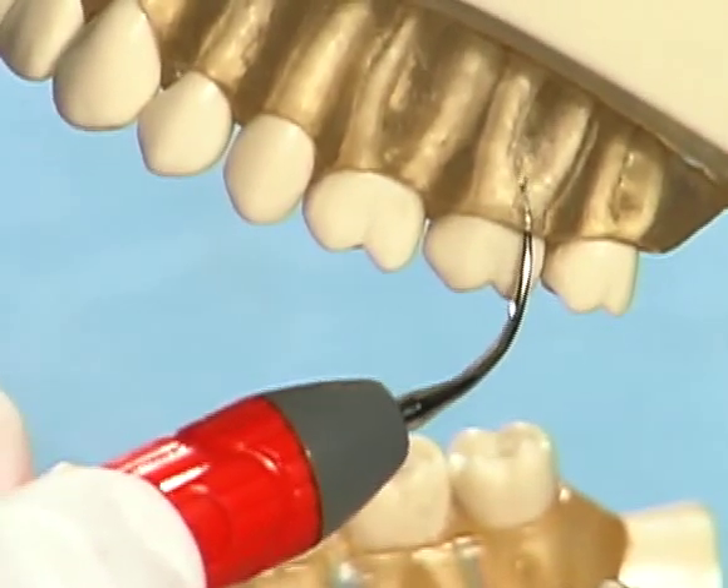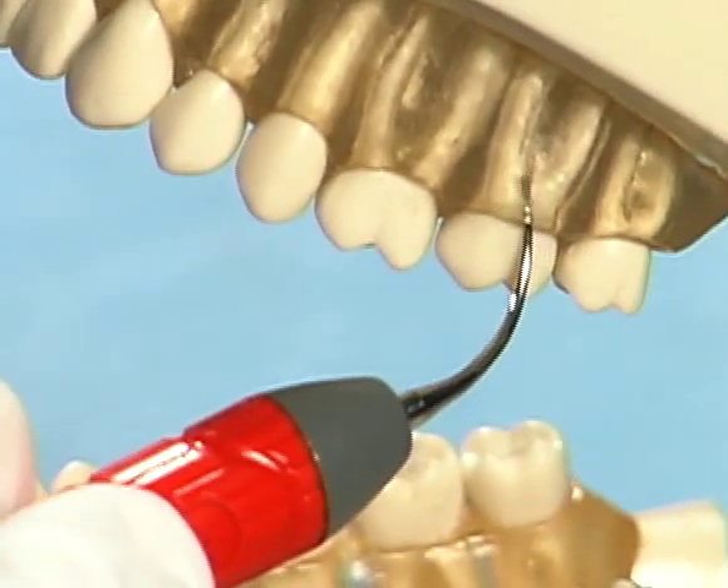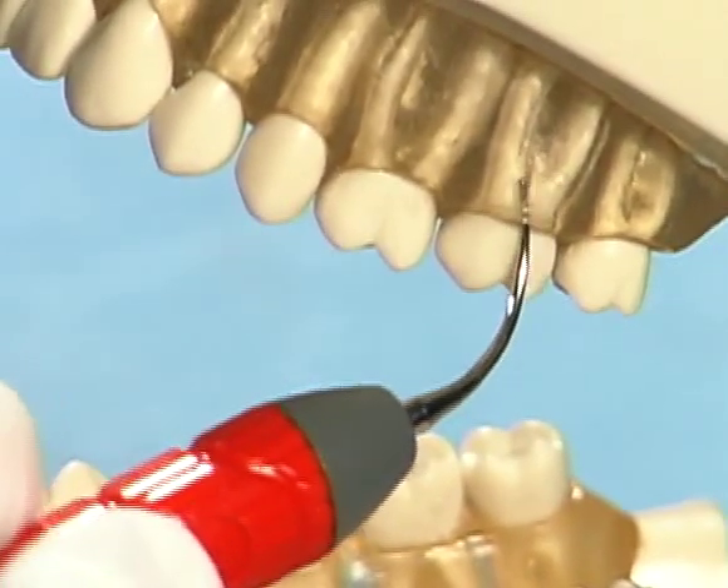Use short, controlled, overlapping strokes to completely cover all surface areas of the subgingival anatomy.